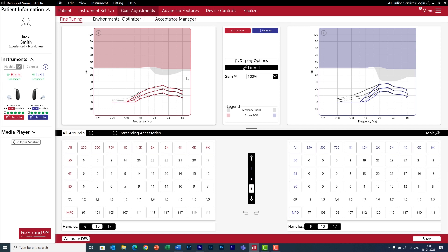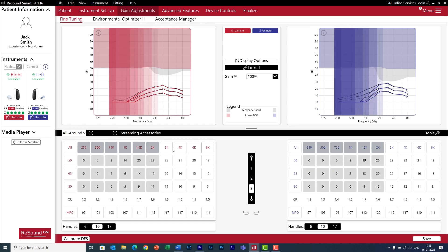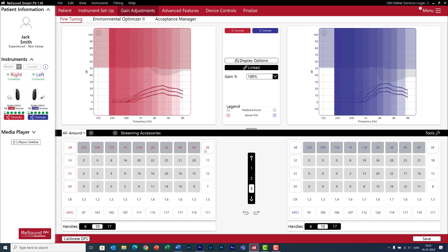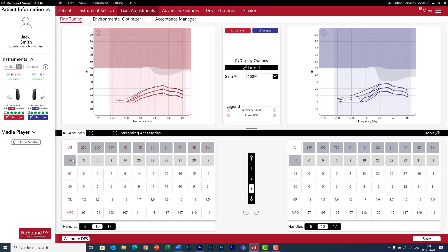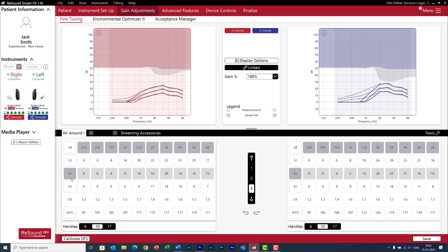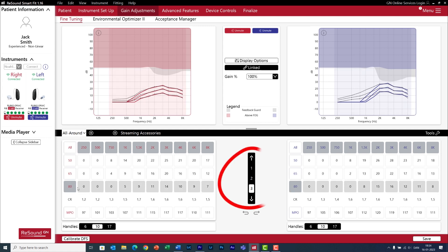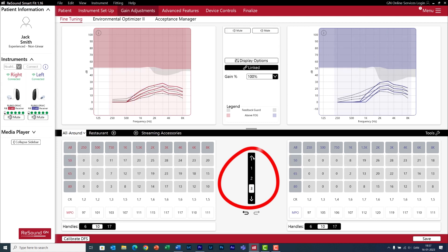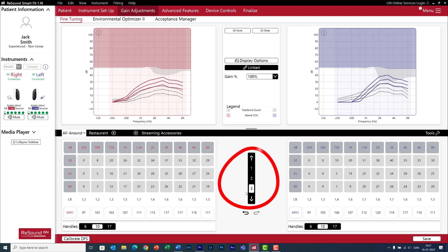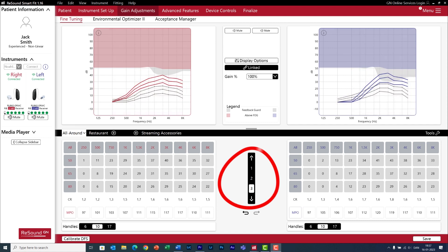Let me go to gain adjustments because this is where the magic happens during a first fit. Here you can adjust the gain of the hearing aids if necessary. This is the frequency range. And you can adjust three input levels: for 50 low level sounds, 65 for conversation level sounds, and 80 for loud level sounds.